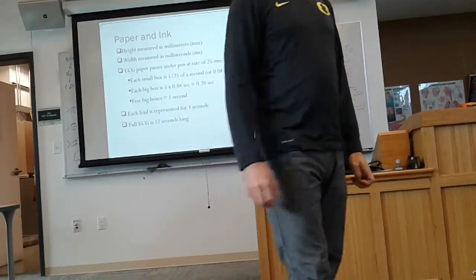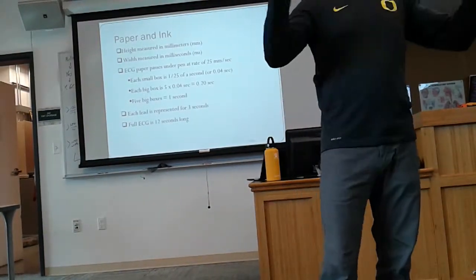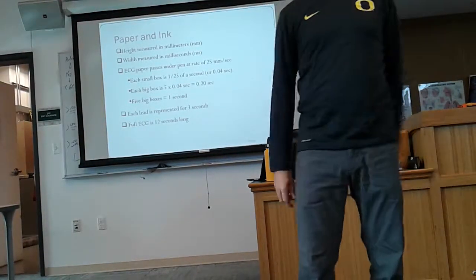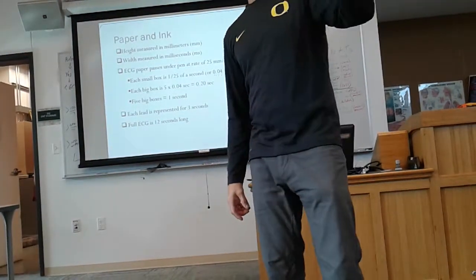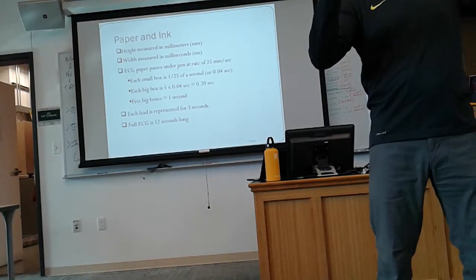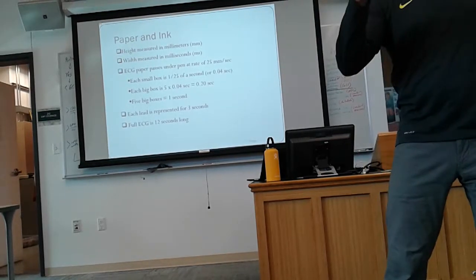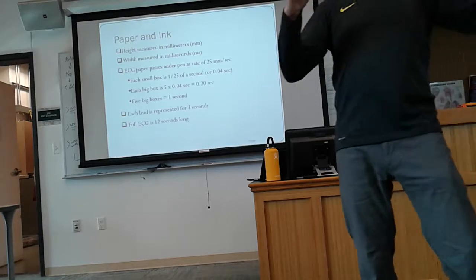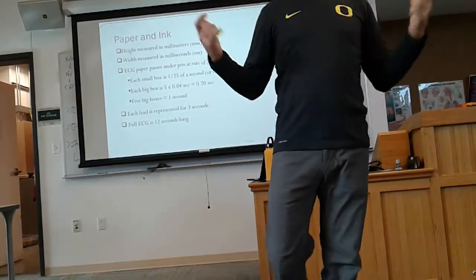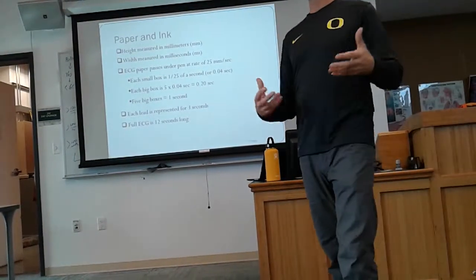We can't make any determinations on the amplitude between patients, from one person to the next. We can't say that, hey, this person has a 5 millimeter QRS complex, and this person over here has a 7 millimeter QRS complex, so therefore this second person has more electricity going on. That we can't do because we have to take into consideration impedance, how much muscle you have, how much fat you have, how large your heart is, so it's proportional.